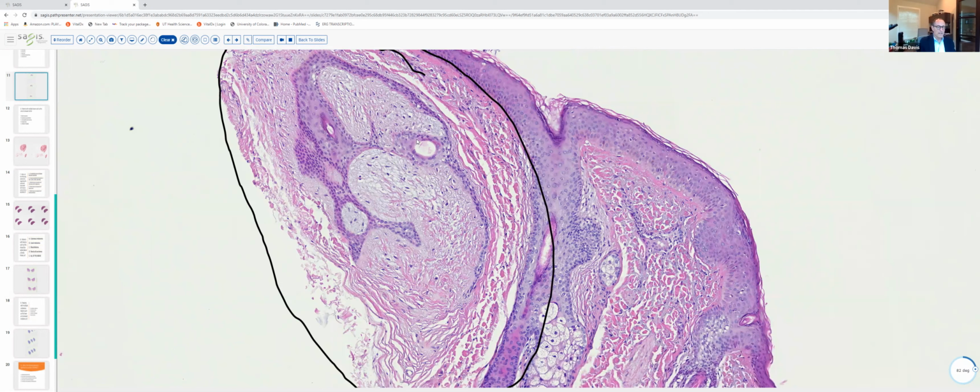And the histology of fibrofolliculomas is somewhat variable. Some of the lesions can be quite large, some can be quite small. And it's generally accepted now that the fibrofolliculoma and trichodiscoma are part of the same neoplasm. It used to be that the mesenchymal portion of this neoplasm was felt to be separate, a trichodiscoma, and the epithelial component a fibrofolliculoma.